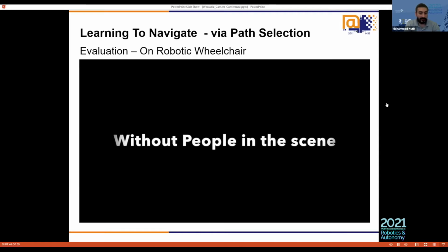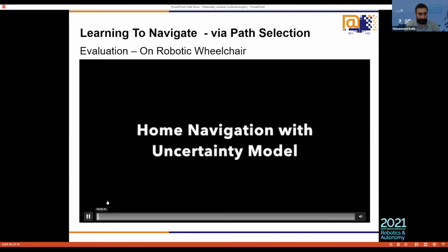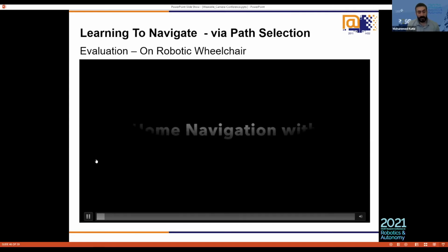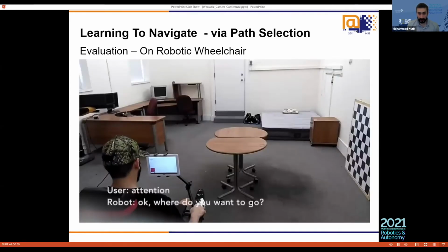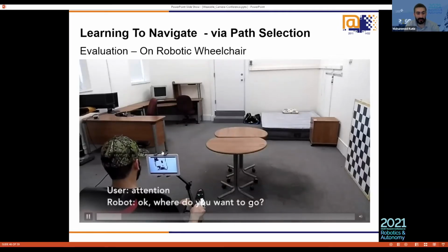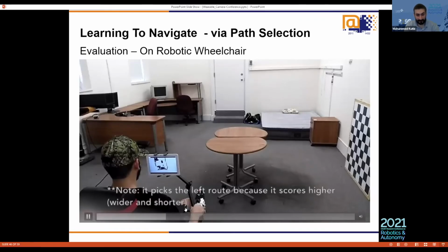And here's a quick video on the uncertainty model, showing when to involve the system, when to involve the user, and when not to involve the user in the same home navigation scenario. It did not ask about the route.